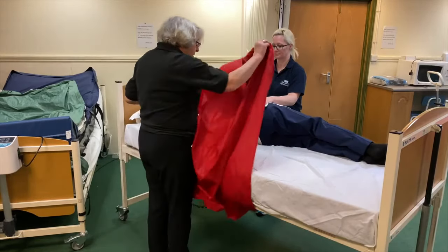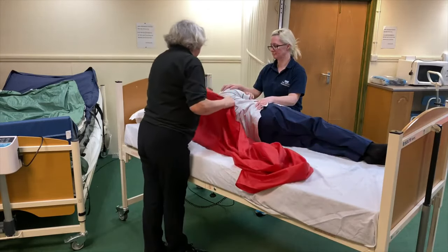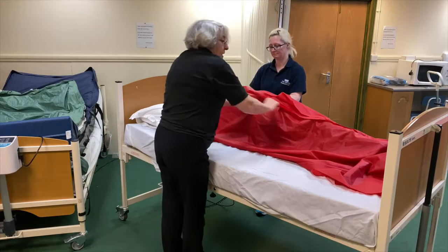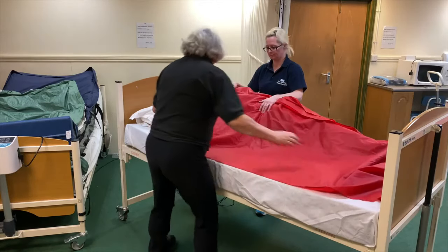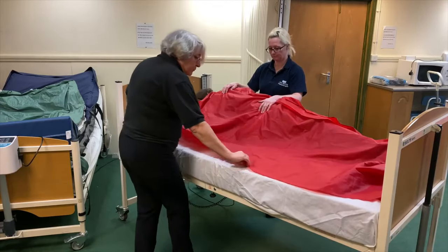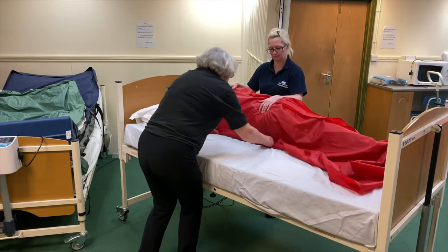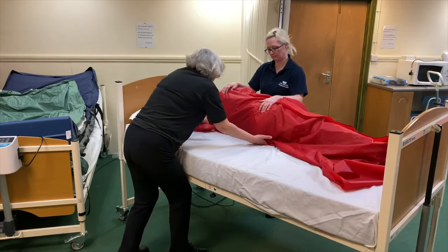This is a full length slide sheet, so it is going to go on her shoulder, encompassing her neck, and Lisa's going to put her hand and hold that, and it's going to make sure that it falls down her body and encompasses her heel. So if you can put your hand just on top of that. Right, so that's in place now. There are lots of different ways, but we find this is a quick and simple way. Somebody's in roll. I'm now going to just fold up the slide sheet like this next to her body, and then I'm going to push it under her buttocks and her shoulder.